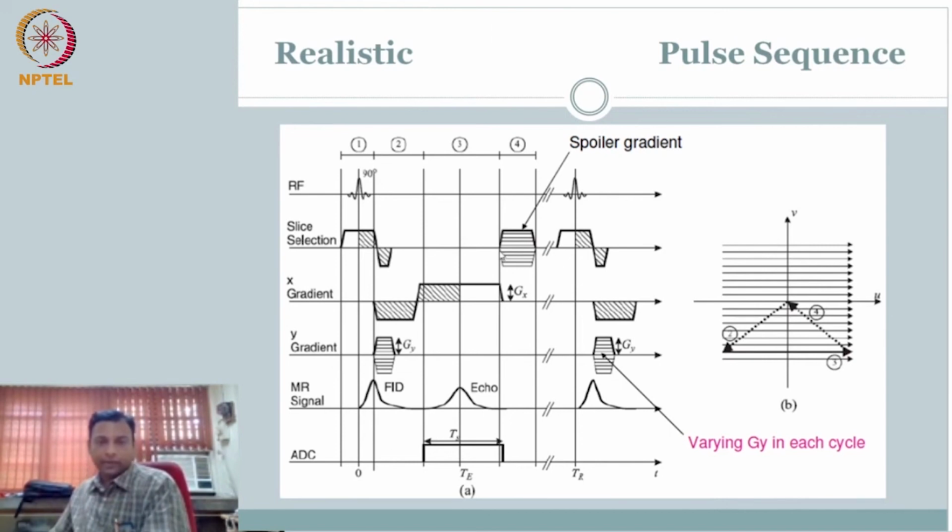This is a new guy. So this is for one sequence, and you repeat the sequence multiple times. So we have put a breaker here on the time axis, and said the next repeat of the sequence starts. So we have incorporated repetition also in our pulse sequence diagram. Now, just before you repeat, we talked about including a spoiler gradient, which is z. The spoiler gradient is each time at different values, just to spoil.